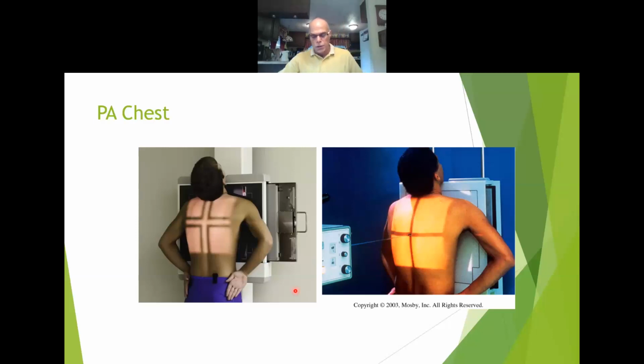Again, your gonad shielding should be a lead shield between the x-ray tube and the patient's pelvis.